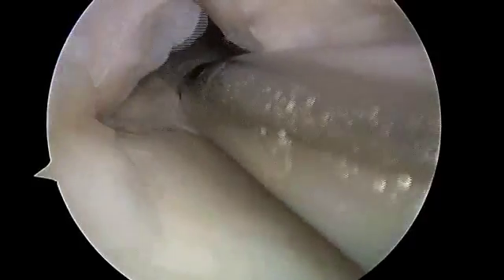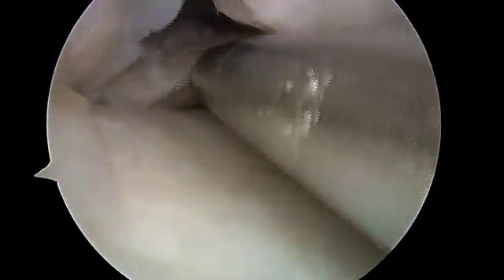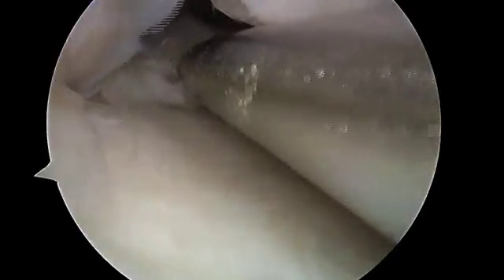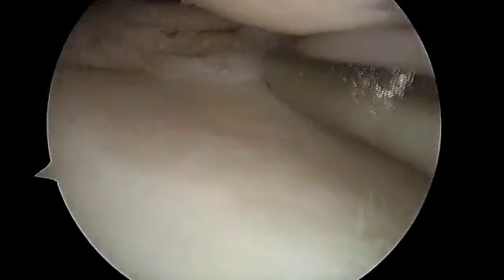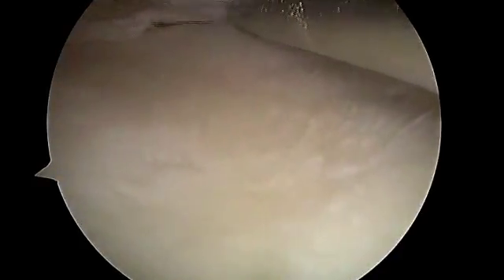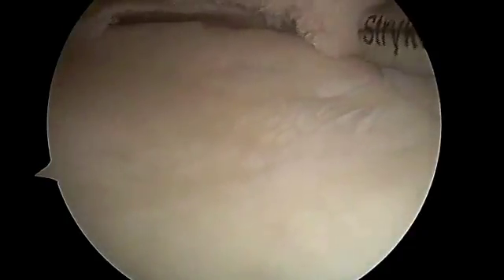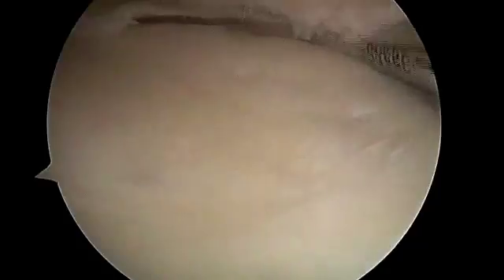We've got a rotary motorized shaver we're going to use to resect the unstable part of the meniscus. We want to try to preserve as much meniscal anatomy as possible — it's there for a reason — but the unstable portion is not doing anything but creating havoc. You can see below the motorized shaver.